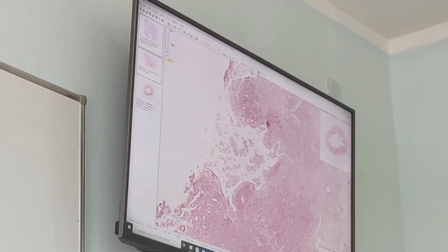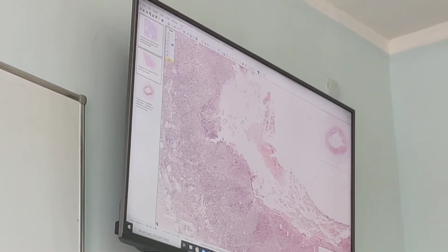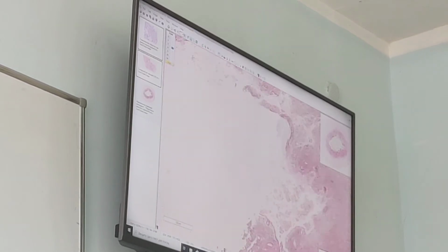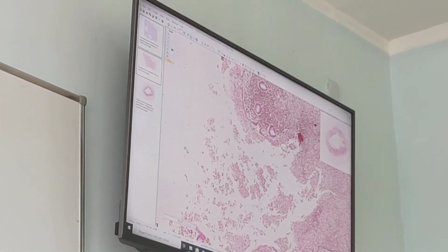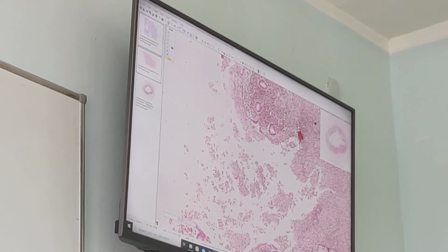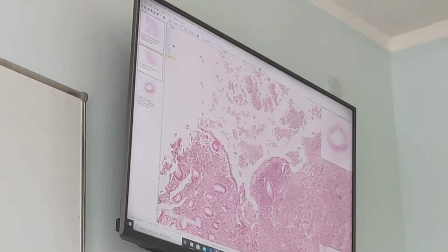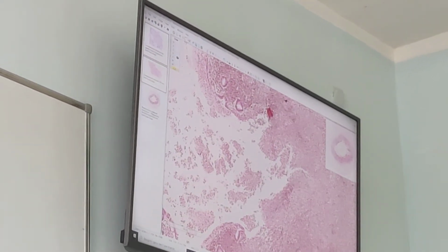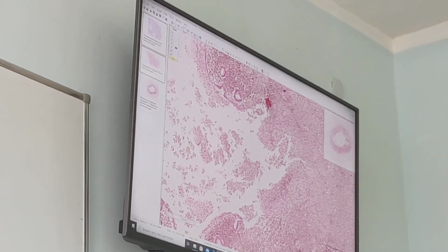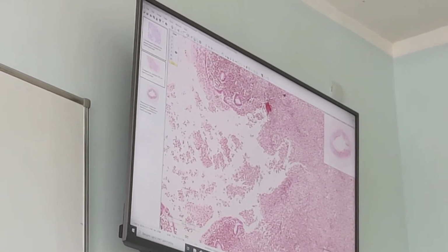Why ulcerated? Because in the mucous membrane we can find defects, erosions and ulcers. About these defects, usually normal appendix mucosa is covered by single layered columnar epithelium. Here it is. Damage. And there. But in this area epithelium is absent. So this is a defect in the wall, erosion with consequent transformation to the ulcer. So that's why it's ulcerated. Phlegmonous, ulcerated appendicitis.